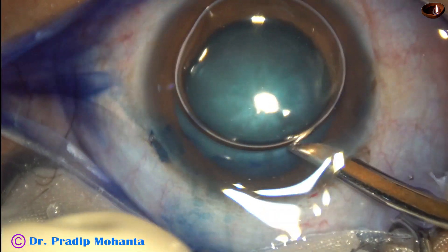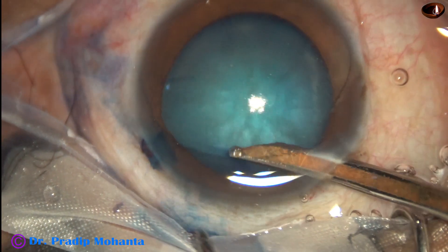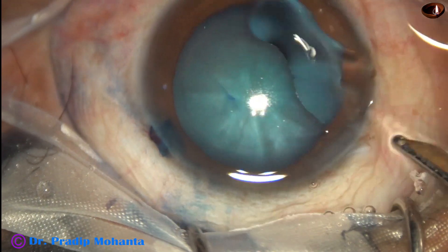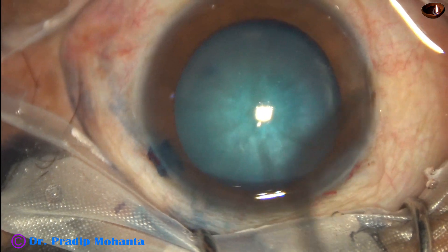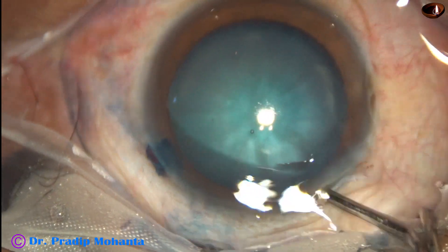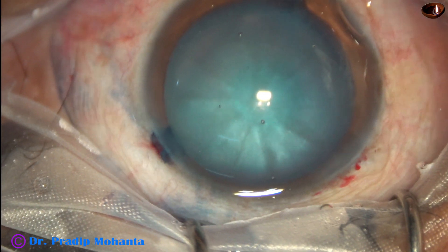The anterior capsule should be stained because we cannot see the capsule. To get some contrast, you must stain the anterior capsule. When the dye was not available, we have done rhexis in such cases without dye, but there is no point in not using the dye at this time.